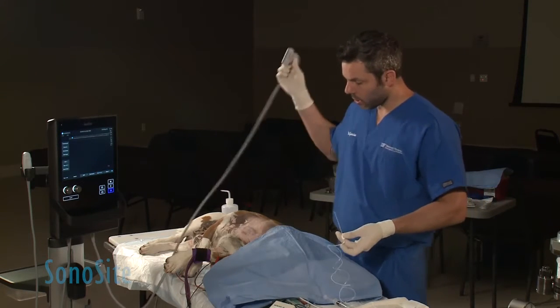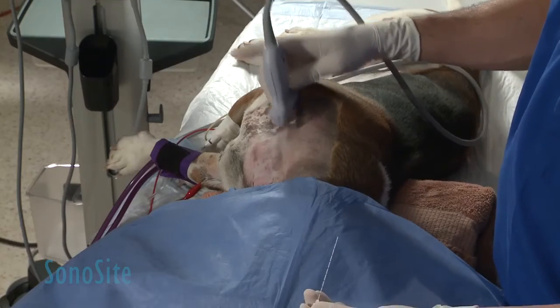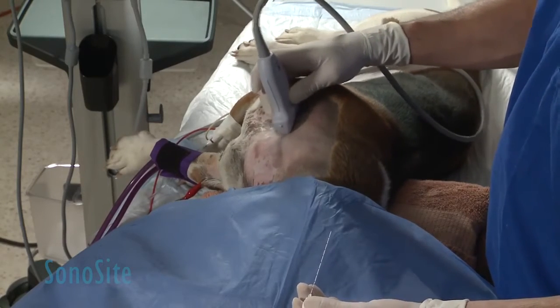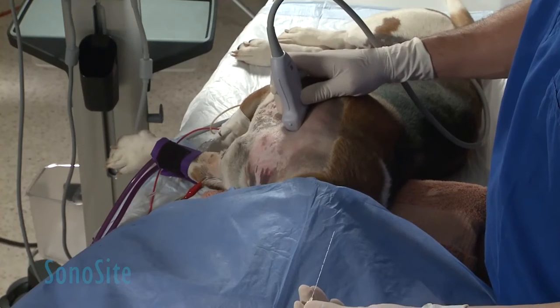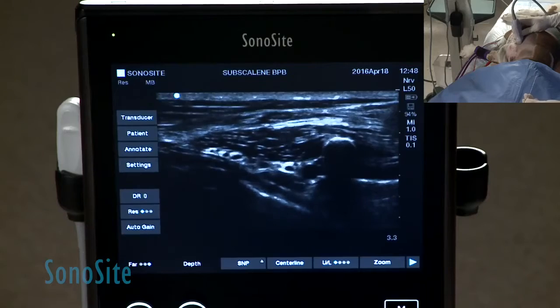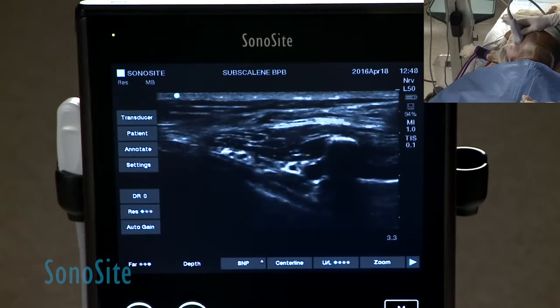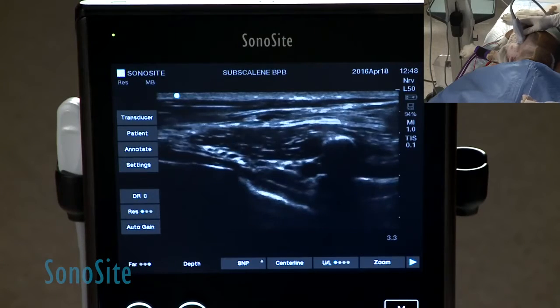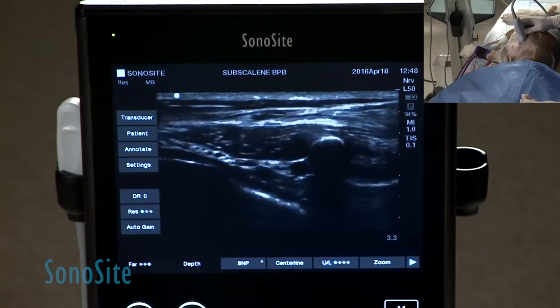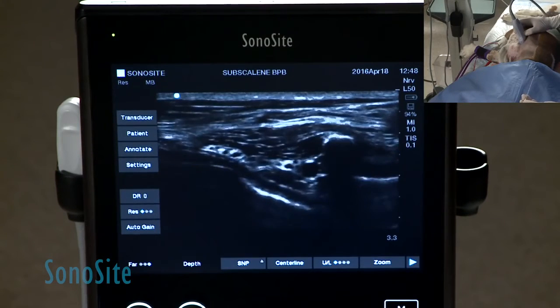When we look at these structures, we can scout this image by putting the probe just on top of the first rib. From the most ventral portion, I find the rings of the trachea. I can keep moving up until I find the rib and basically the roots of the brachial plexus, just coming out from under the scalene muscle.